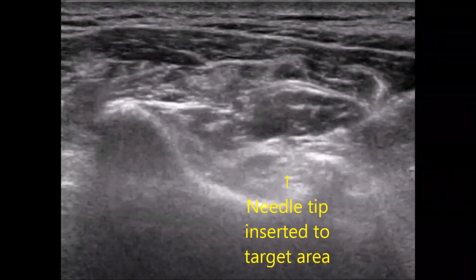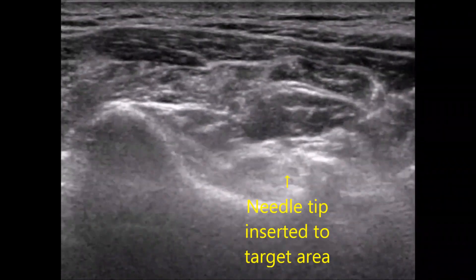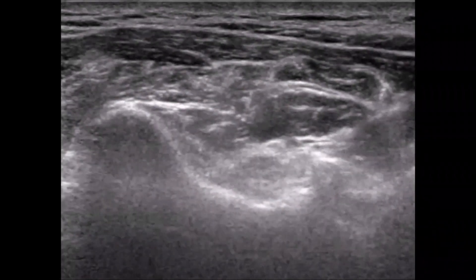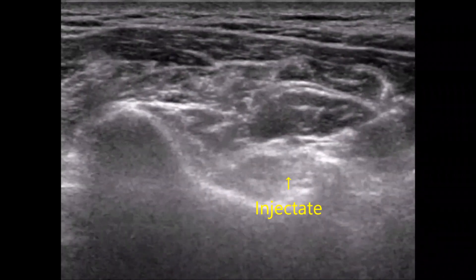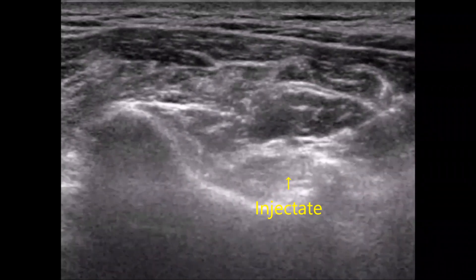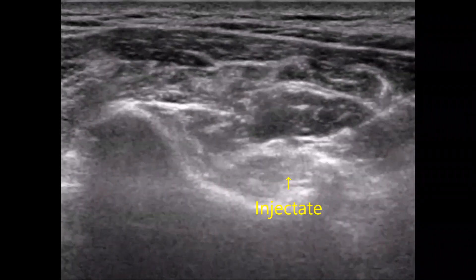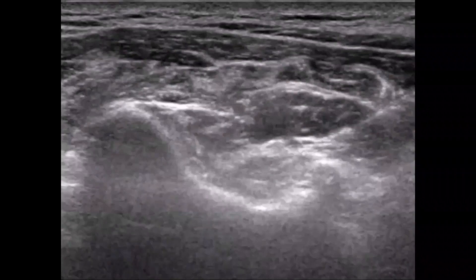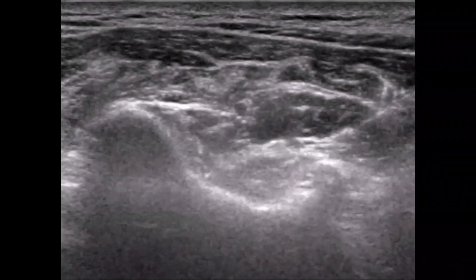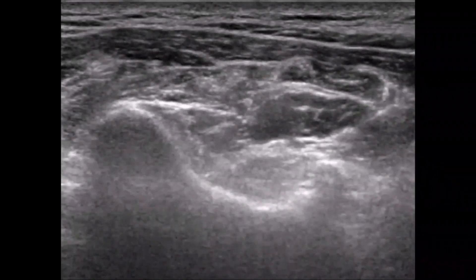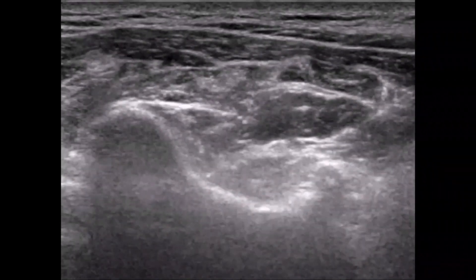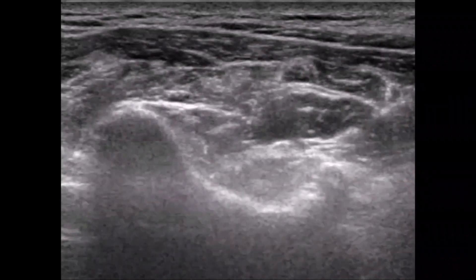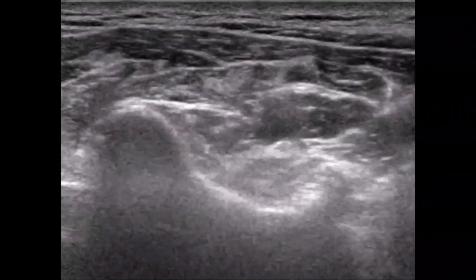The needle is then slowly and carefully inserted to this area, with the injectate slowly injected. After the completion of the injection, the needle is then slowly retracted from the injection target area.